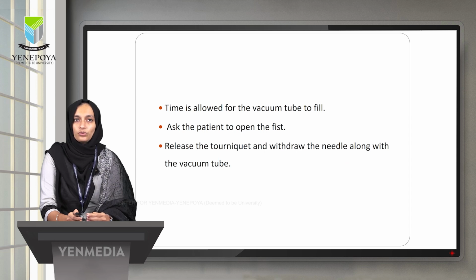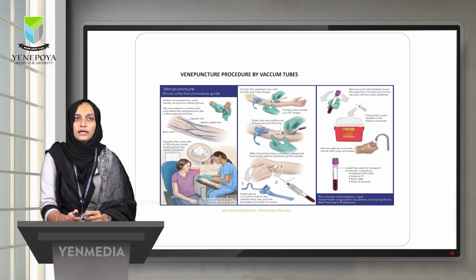Then time is allowed for the vacuum tube to fill. Then ask the patient to open the fist, release the tourniquet and withdraw the needle along with the vacuum tubes. This is the procedure, which I have already mentioned.